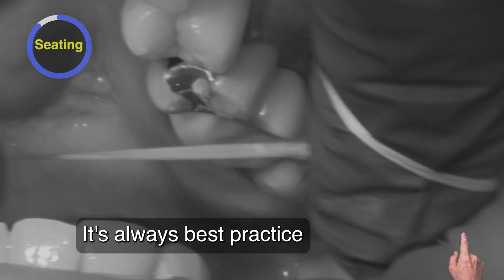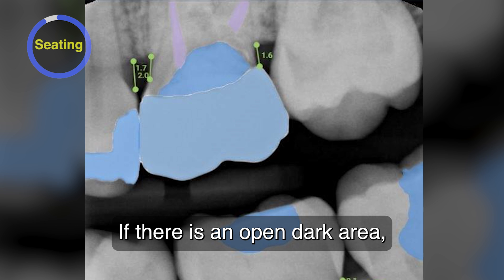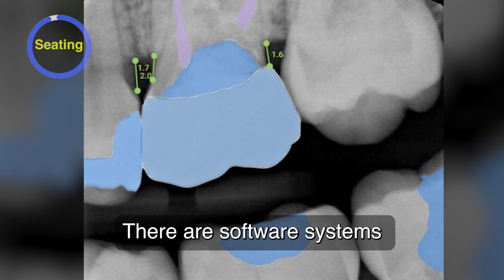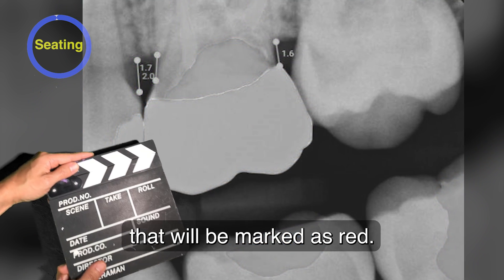It's always best practice to verify the fit with a bite-wing radiographic check. If there is an open dark area, further adjustments are needed. There are software systems like Overjet that can analyze your radiograph for open margins, which will be marked as red.